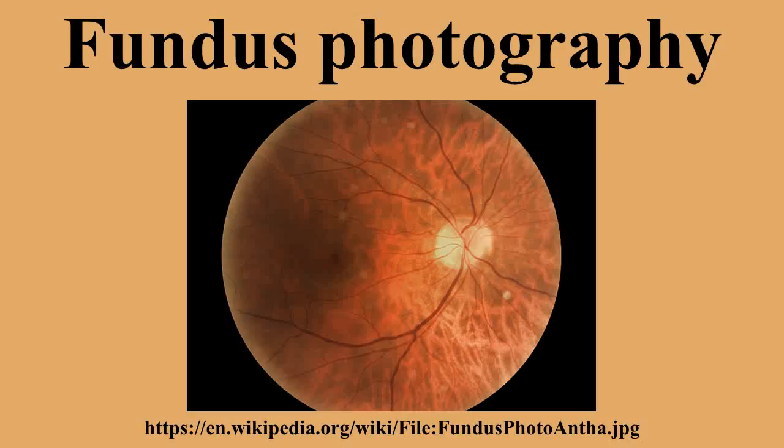Sodium fluorescein angiography is used for the imaging of retinal vascular disease and utilizes blue excitation light of 490 nanometers and fluoresces a yellow light of 530 nanometers. It is routinely used to image cystoid macular edema and diabetic retinopathy, among others.